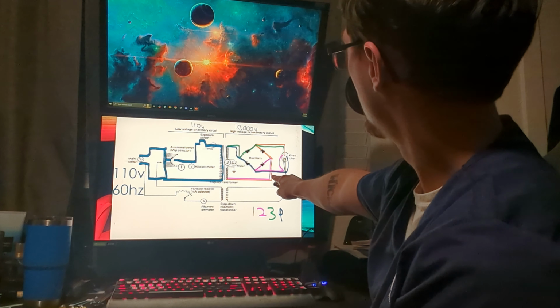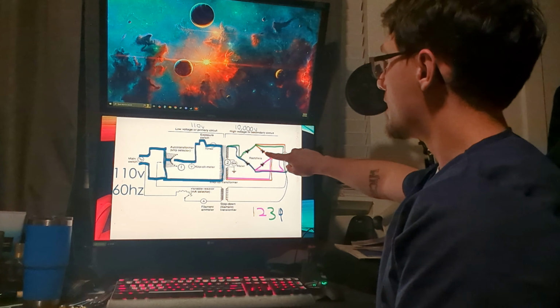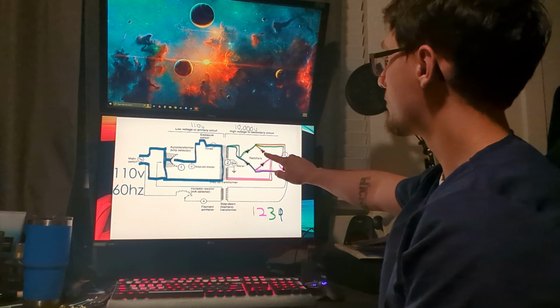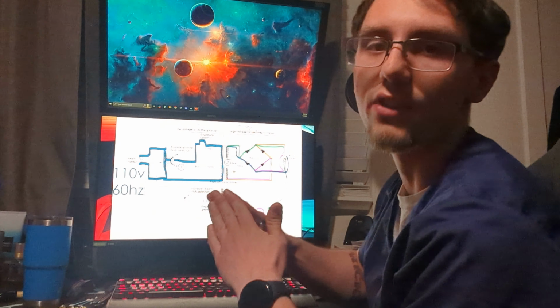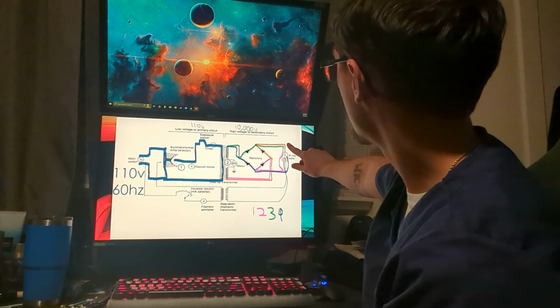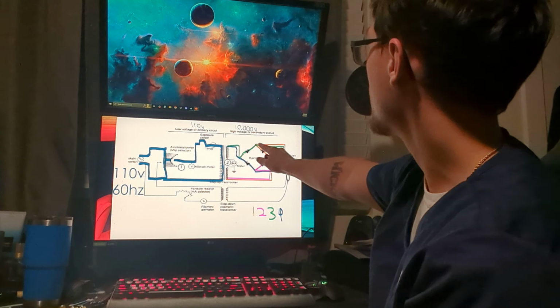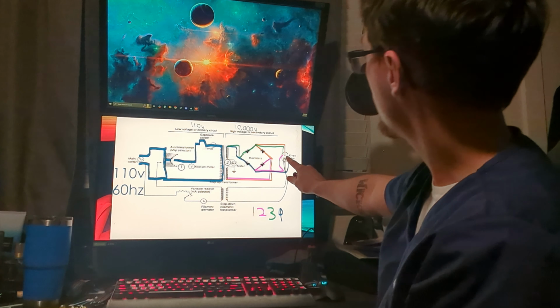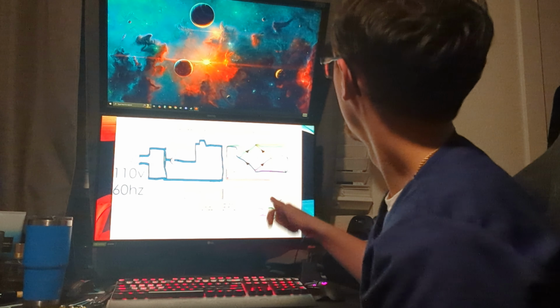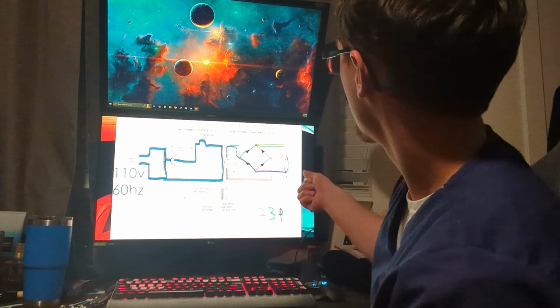So we'll follow the orange line here first. Go over to the right, go up, go through to the diagonal to the left, and then you can only pass through the backs, or the side here that doesn't have the smaller portion of the triangle. Okay? So then we have to go through that side, over to the right, because we can't go this way, right? There's a block here. We cannot go left. We go over here to the right, we go into the actual X-ray tube on the anode side specifically, and then we'll come back out after completing the circuit inside the anode side.